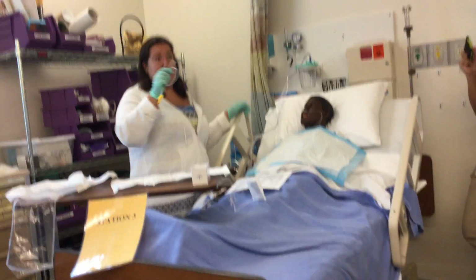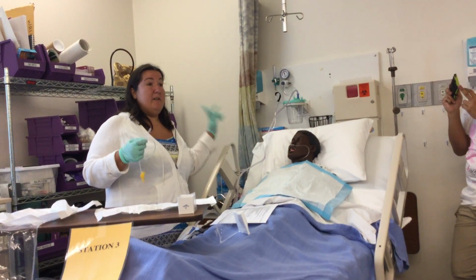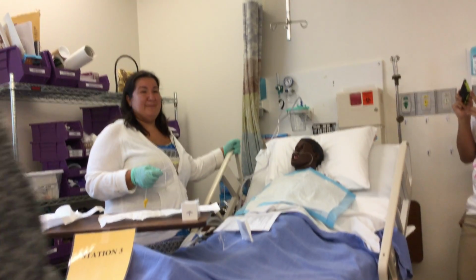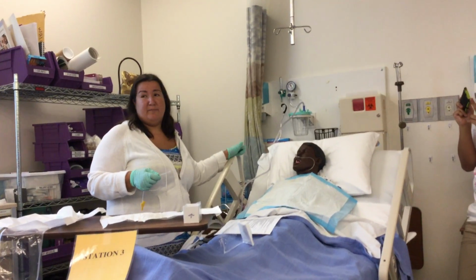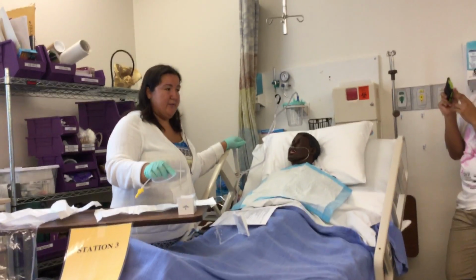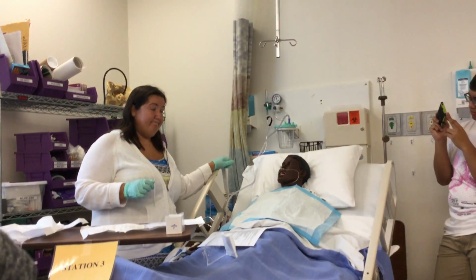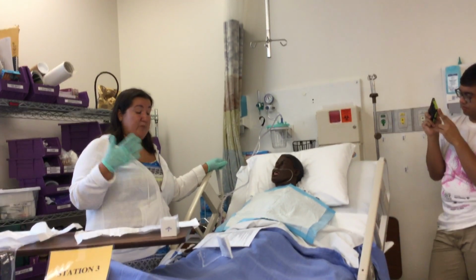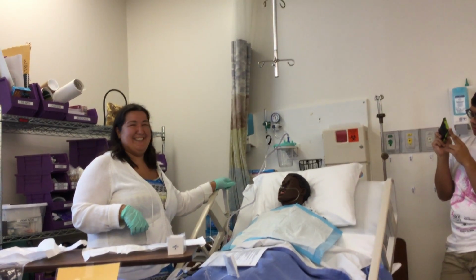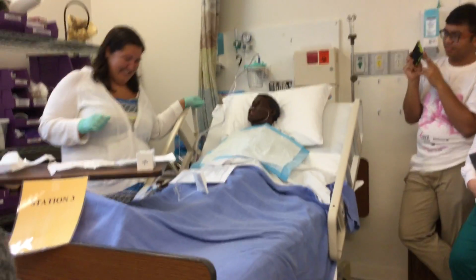The only places that have real working suction, because these were all pre-built before we got here, are the two sim centers we built. They actually have it on an air compressor that really suctions. The other ones don't really suction. Do you want us to actually suction the mouth also? Yes, as part of the return, you're going to do it. But just be aware that in real life, if they're combative and confused, you don't want to put the catheter in, because then you'll be wrestling them for it, and they can bite the end off, so that's not good.